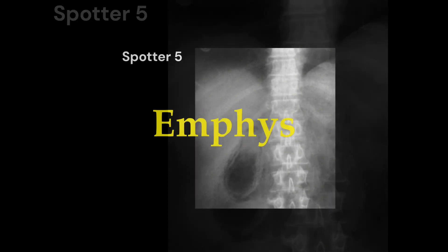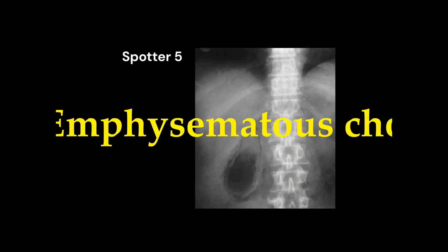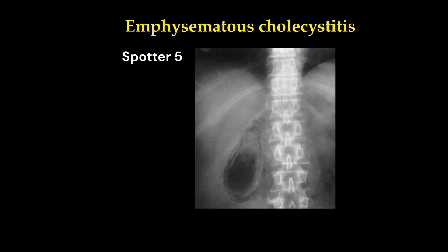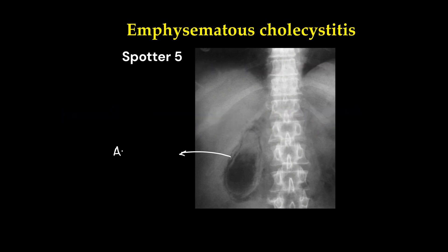This is emphysematous cholecystitis. We can see air foci in the gallbladder wall and lumen, in the shape of the gallbladder itself.